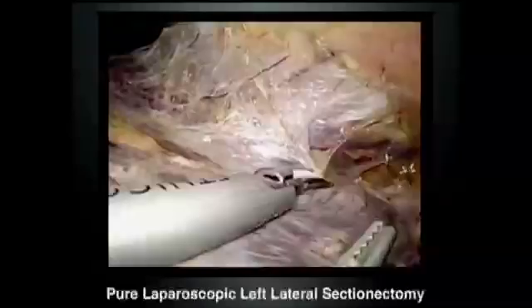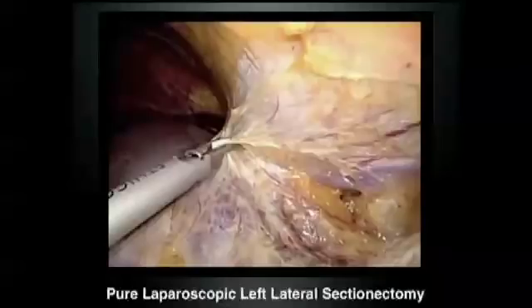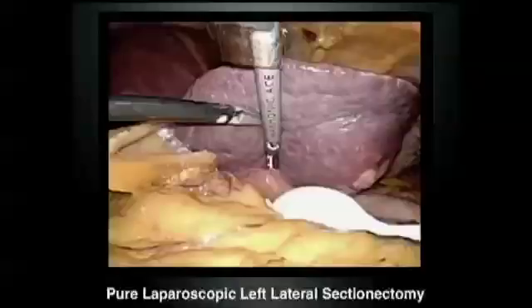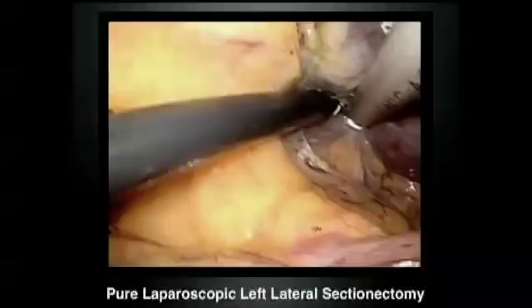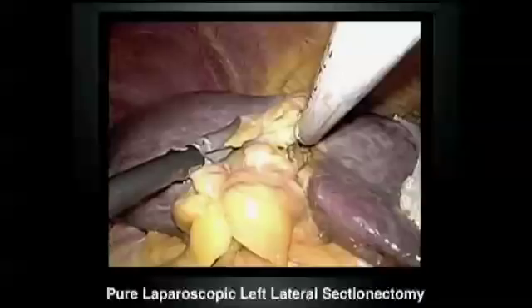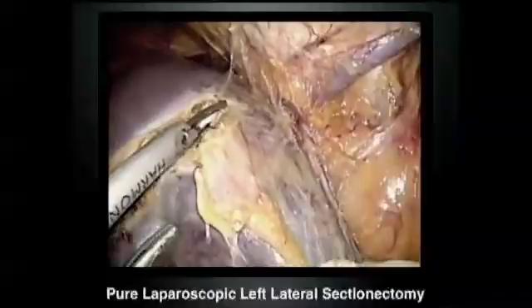This is a typical left lateral sectionectomy. The procedure itself is very well established. Intraoperative ultrasonography is important to identify intrahepatic structures. This is a tumor located in segments 3 and 2. All we have to do is reduce the size of the liver parenchyma to finally apply the stapler. An ultrasonic coagulator and bipolar forceps can be used for surface parenchyma transection.